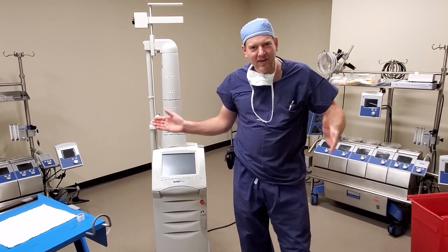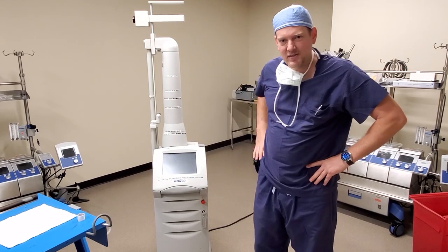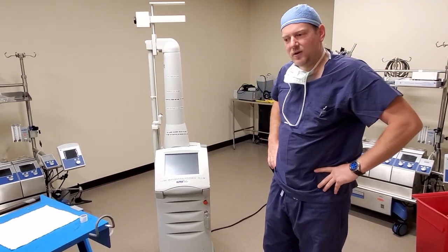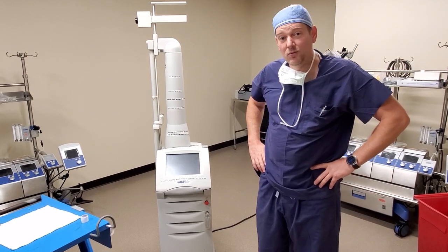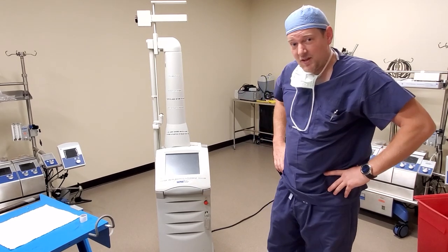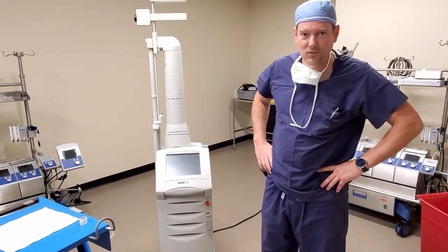Hey everyone, welcome back to BetterBombAid. Today I've got a special for you: CO2 lasers. A lot of people don't know about CO2 lasers or how to adjust the beam, so we're going to go over a brief amount of that. Let me show you around the laser so that you're more familiar with it in case you have to troubleshoot one in the field while they're using it.